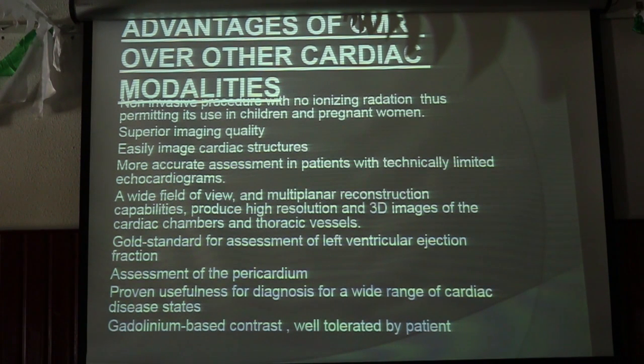It's the gold standard imaging modality for evaluation of left ventricular ejection fraction. It's used for assessment of pericardial disease and pericardial anatomy. It's useful for diagnosis of a wide range of cardiac pathologies. It uses a gadolinium-based contrast material. Therefore, it's well tolerated by patients, with a very low incidence of allergic reaction, and has no nephrotoxic effect.